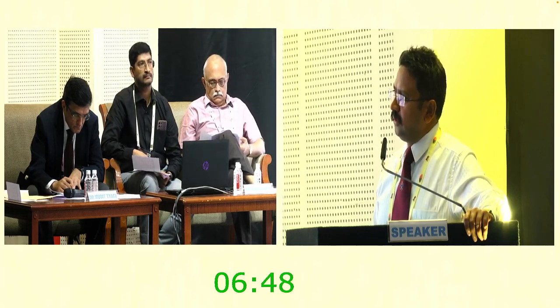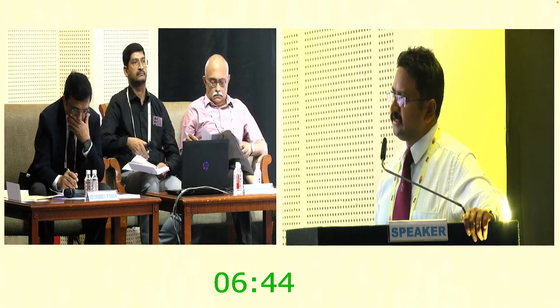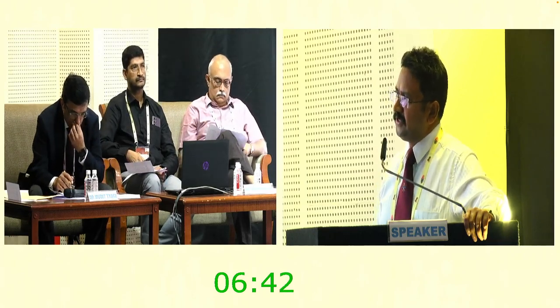Have you compared this technique with other techniques? I have compared with Yamane, but we have not yet completed that. So in 10 patients, the amount of tilt was more in Yamane plus the chances of flange exposure. In one of the patients, there was a flange exposure in 6 to 7 months. We'll open it for the judges now.